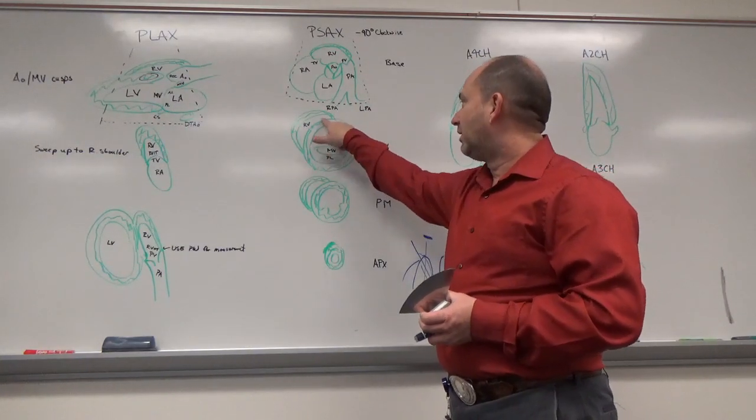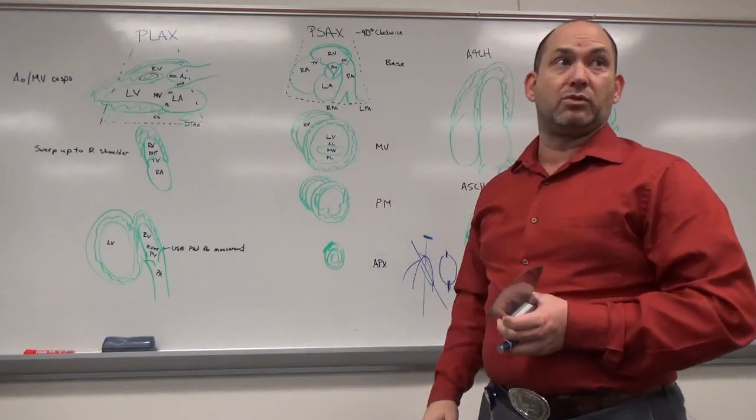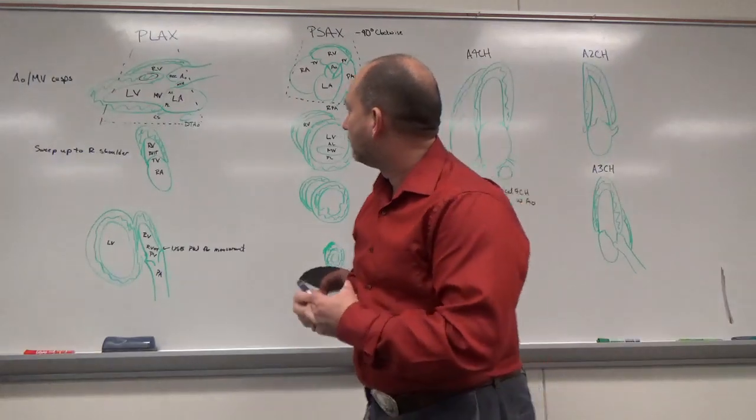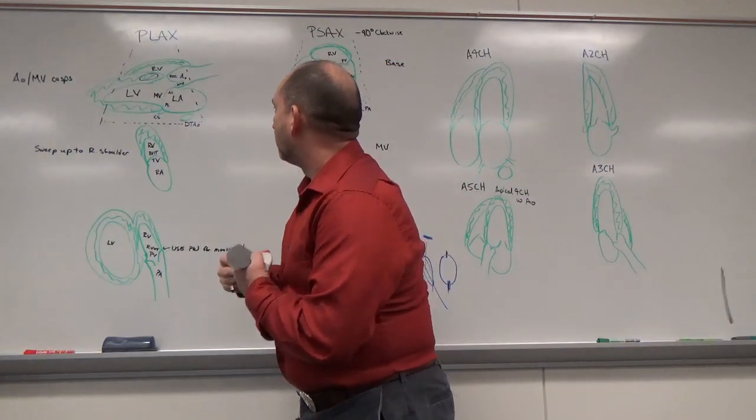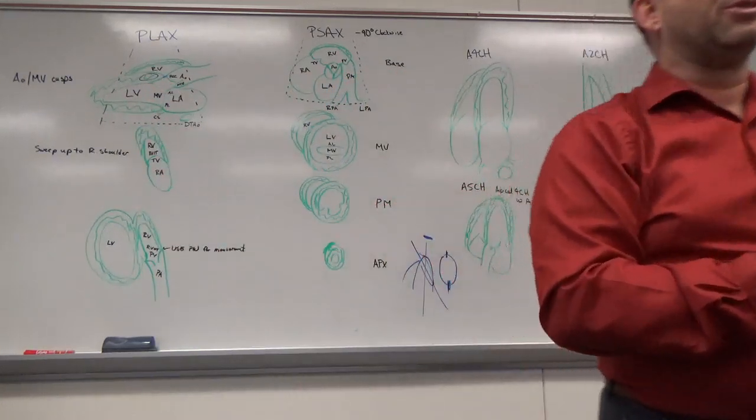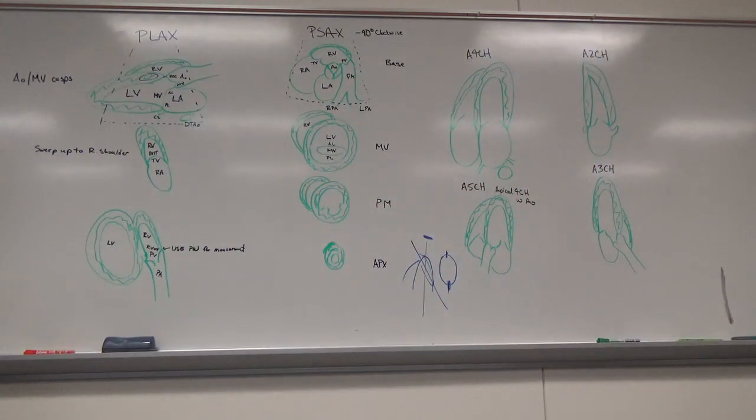No, because it needs to go out in that area, because when we're scanning that, we see some right ventricle on top of it. And actually, I left a VSD on there, sorry. So we'll put our membranous portion of the interventricular septum there. Good. So that's our view.